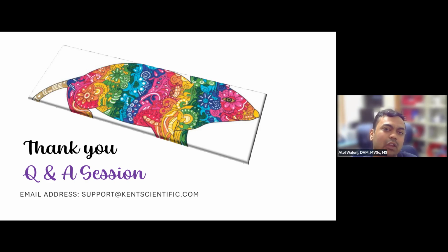You can also have the homeothermic mode switched on, where you have one thermal probe in the rectum of the animal and the other on the pad, so that there is a feedback-initiated communication, and the warming intensity will be enough to maintain the animal in a stable normothermic temperature range. Usually it's near the normal body temperature of the animal, that is 36 to 37.5 degrees.